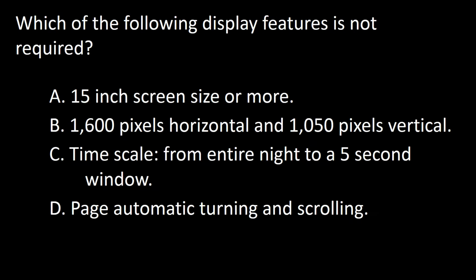Next question. Which of the following display features is not required? A. 15-inch screen size or more. B. 1,600 pixel horizontal and 1,050 pixels vertical resolution. C. Time scale from entire night to a 5-second window. D. Page automatic turning and scrolling.